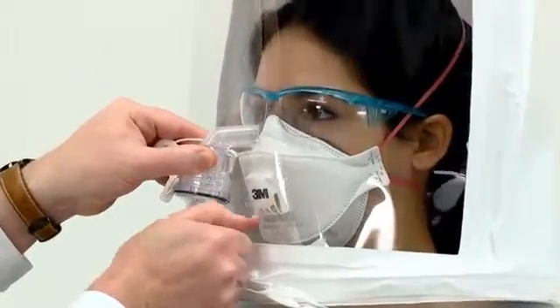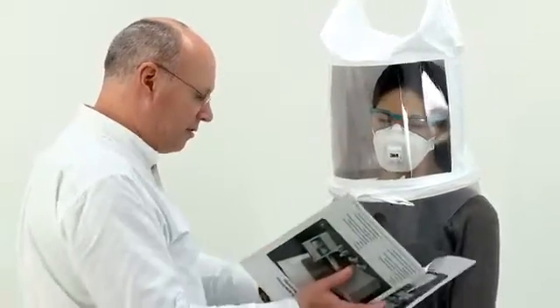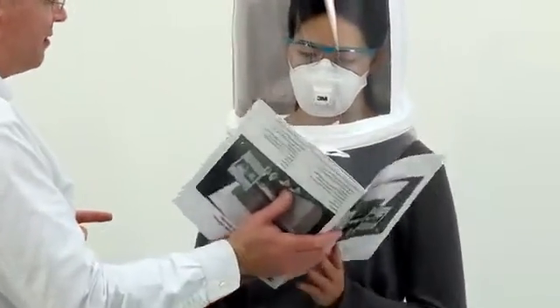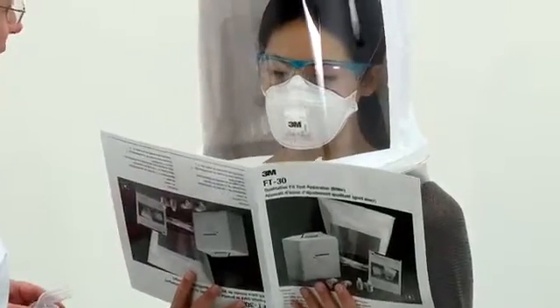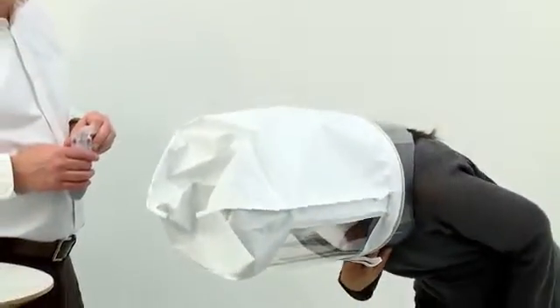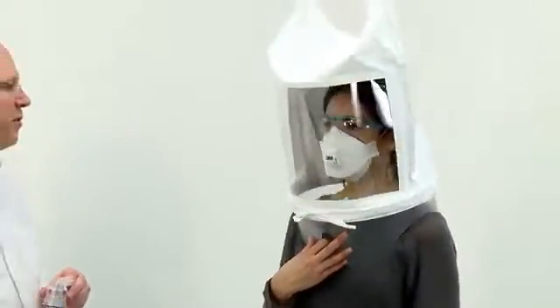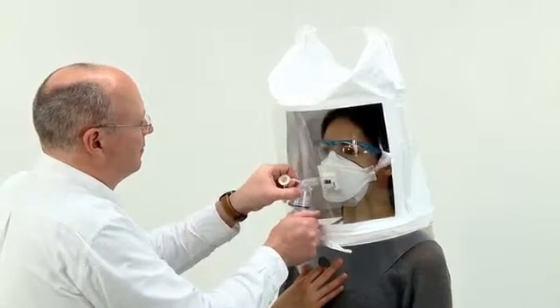After one minute of moving their head up and down, and while still topping up the concentration every 30 seconds, hand the subject the passage of text in the user instructions and ask them to read it out loud. They should re-read the passage for a full minute. After one minute of this exercise, ask the subject to bend at the waist as if to touch their toes. Remember to top up the concentration every 30 seconds.